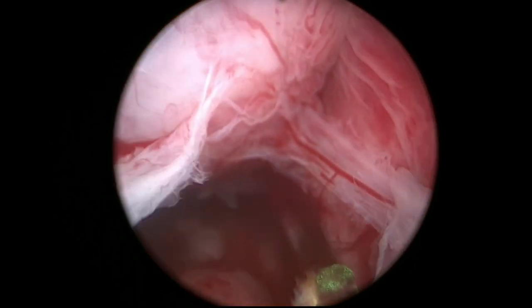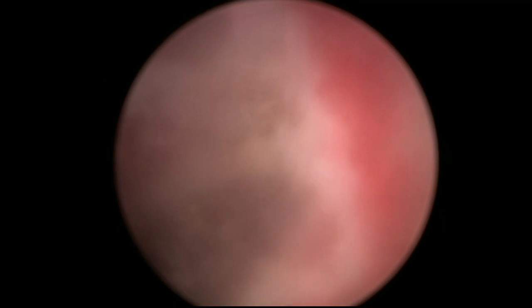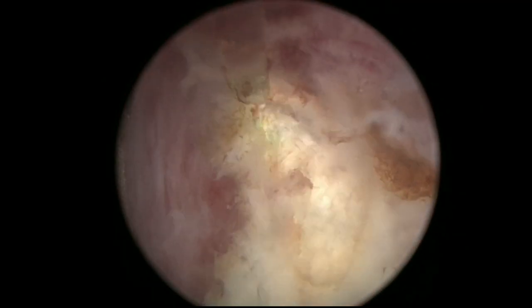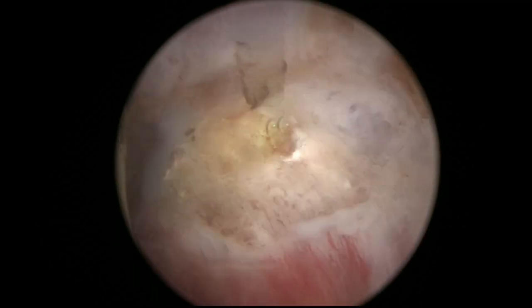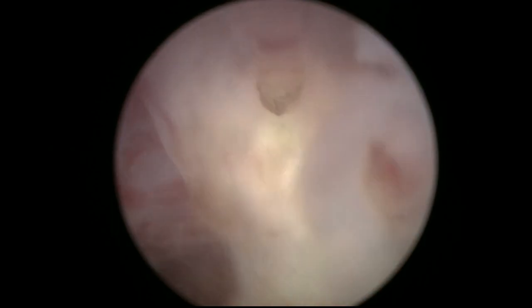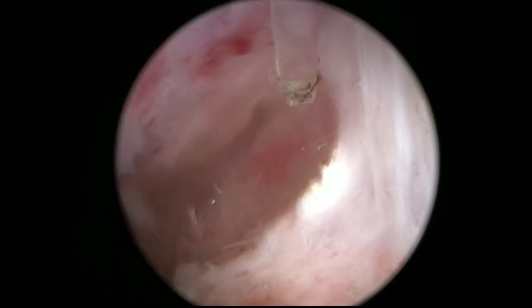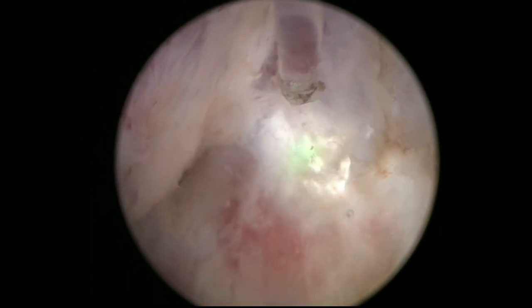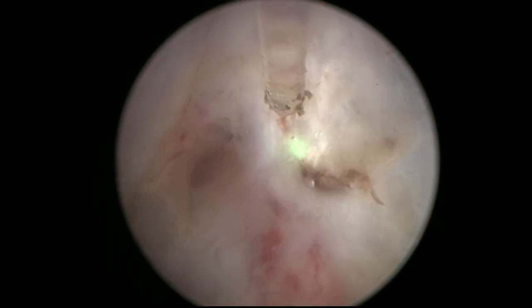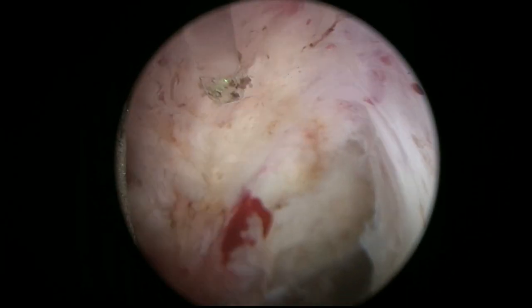Here what I did was to enter in both planes, then developed a little bit the posterior plane. Now I'm coming with the fiber at 12 o'clock to start the early apical liberation. Here I'm cutting on the white line, trying to deepen the white line. When you do this initial cut, you get better access to the proper plane. And here what I'm doing is entering the lateral aspect of the prostate — this is what I call the phase of mobilizing and connecting. You mobilize and connect the apex by entering on the lateral aspect, making sure that the lateral dissection line connects with the previous line.